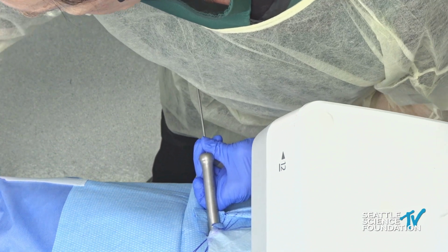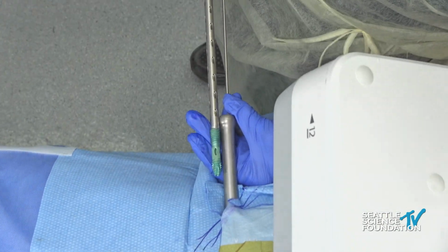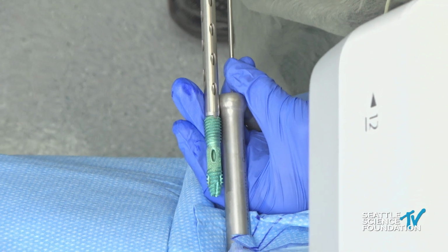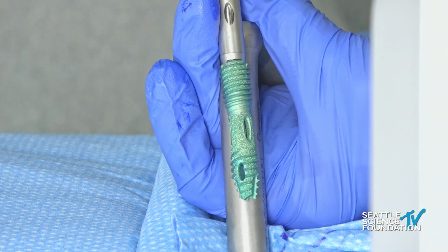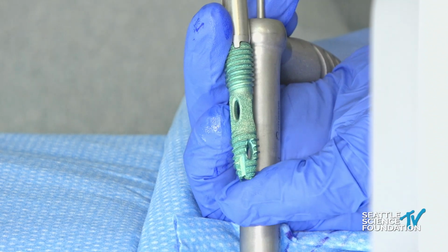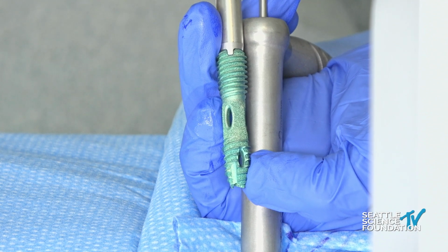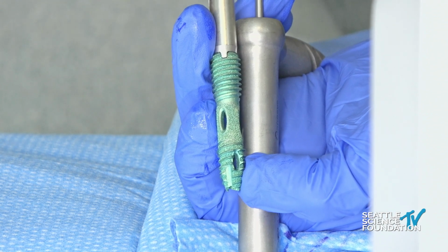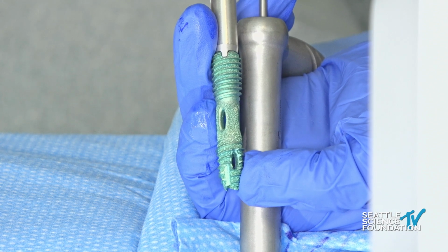And then I'm going to place the implant. And the implant is this. It's 11.5 millimeters in diameter. This particular implant is 55 millimeters in length. And it has features: it's self-tapping. It's rifled on the inside so it doesn't push the pin forward. It's 3D printed. It's roughened titanium alloy. The differential pitch allows for lagging features of the screw.